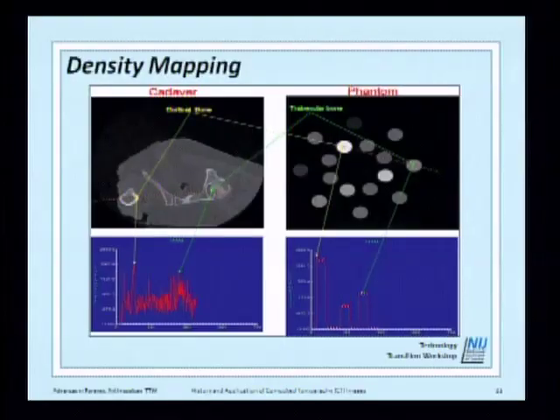So it's a kind of control and takes away the worry about doing the same scan with a different machine. If you go to another machine, you use the Phantom. So in this case, you don't have to worry. Now you can adjust the intensity level like this curve. So you adjust the intensity level, and in this case, you normalize the scans between the machines. So you don't have to worry about all the parameters.